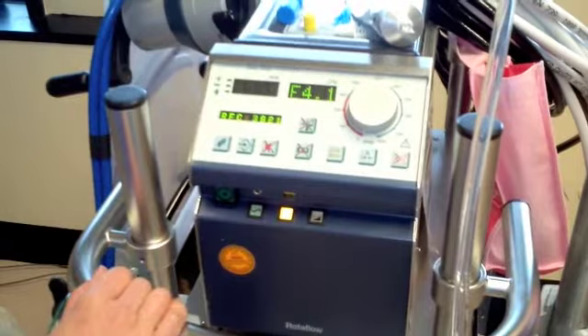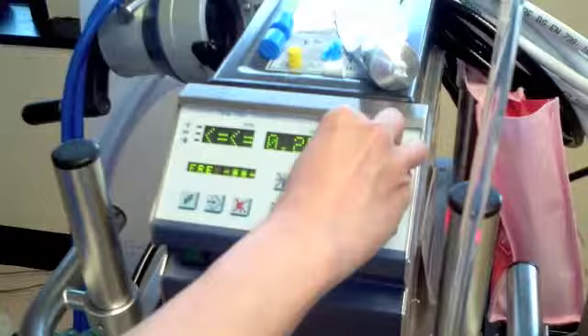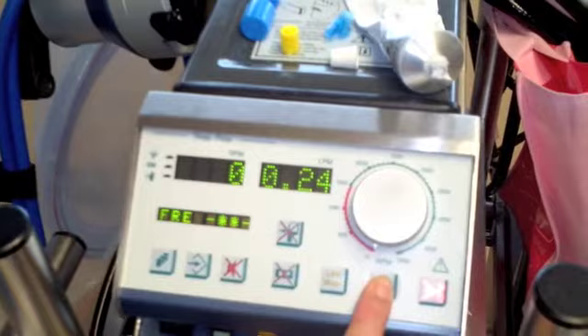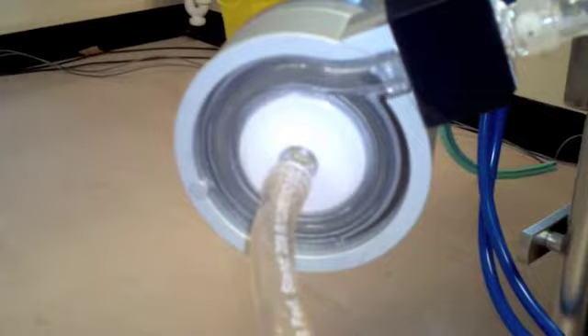We can now turn on the rotor flow machine. First we set it to zero and then we can turn on the flow slightly. This demonstrates air flowing through the centrifugal pump during the initial stage of priming.